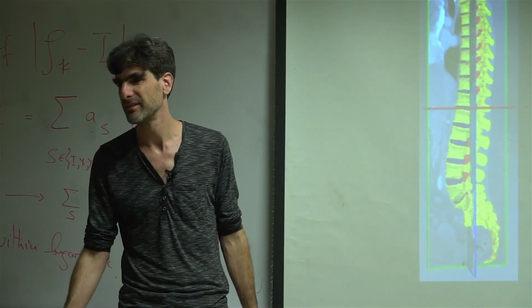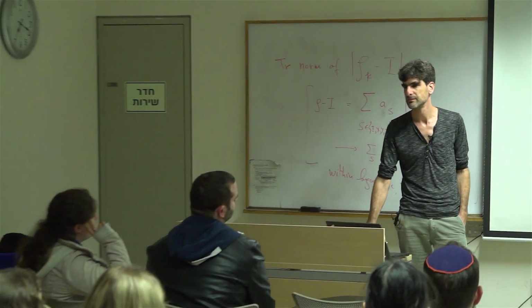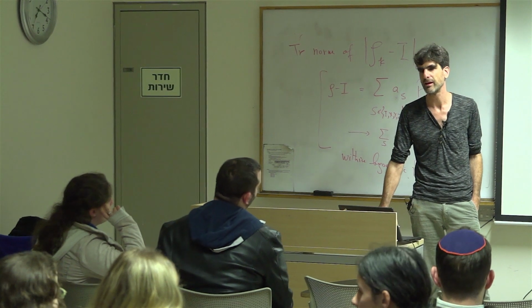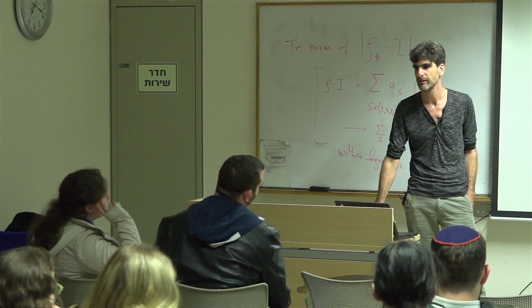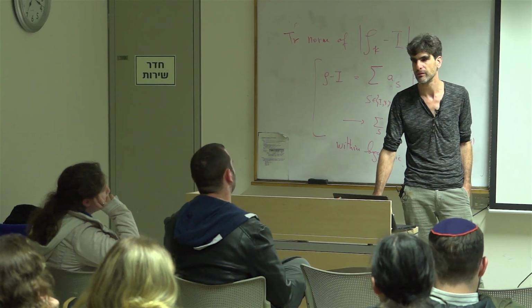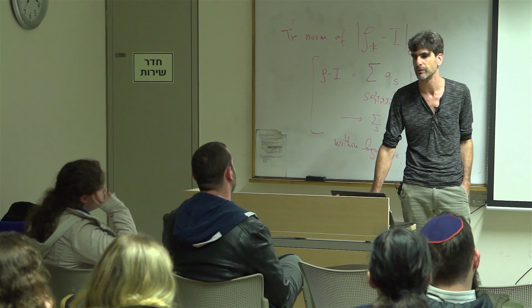Have you tried to enhance your results using MRIs? For this application, I think MRI is going to be less accurate, and they use it less. They use CT typically. Accuracy is better. MRI is more suitable for soft tissue, for brain.